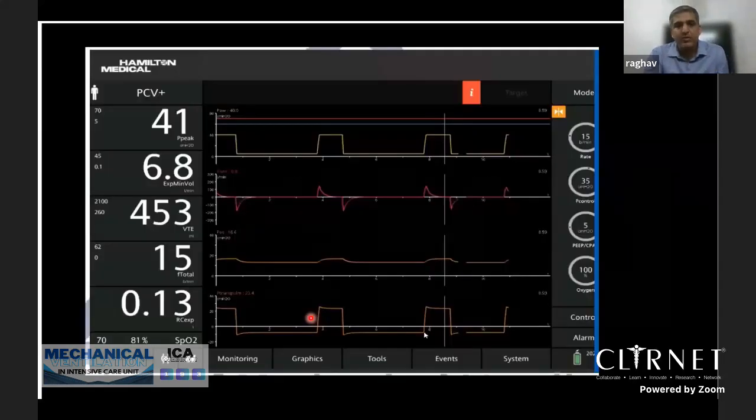So I will give you an example of this ventilator screen. You can see that the first one is the pressure time scalar, the second is the flow scalar, the third is the esophageal pressure graph, and the fourth is the transpulmonary pressure graph. Transpulmonary pressure is nothing but airway pressure minus the esophageal pressure. This is the inspiration and this is the expiration. As you can see, we have set the PEEP to 5, and at this PEEP, the end expiratory pressure is negative. This is below the baseline of 0. That is, the end expiratory transpulmonary pressure is negative. This will lead to collapse of alveoli.